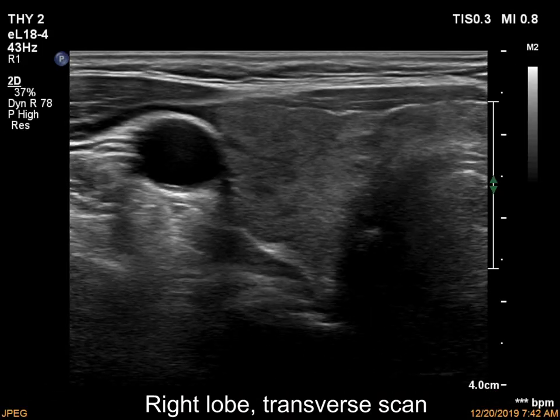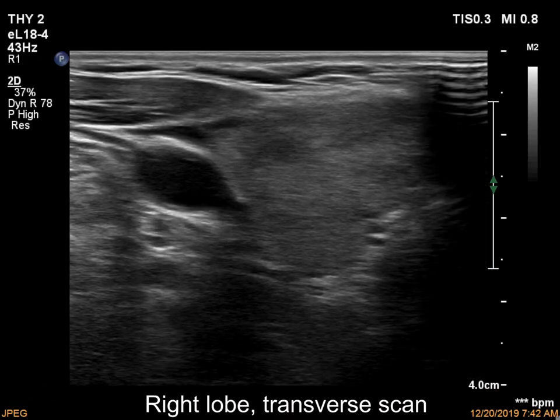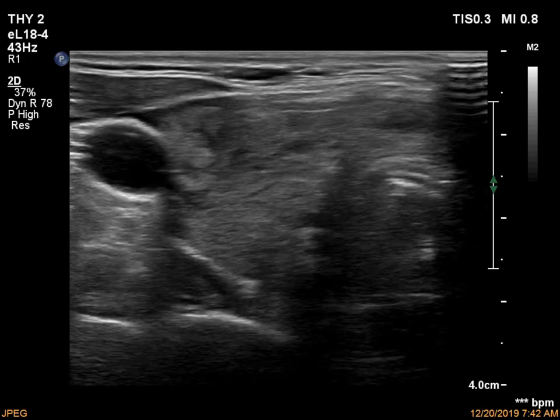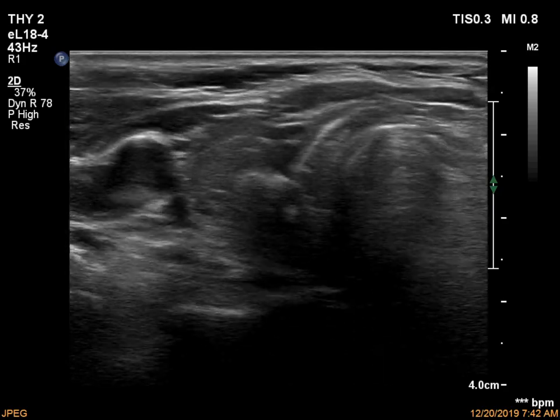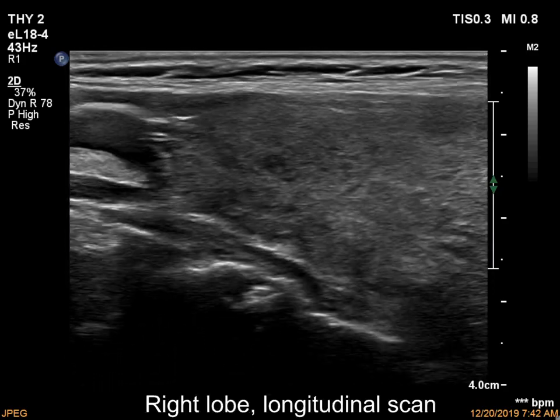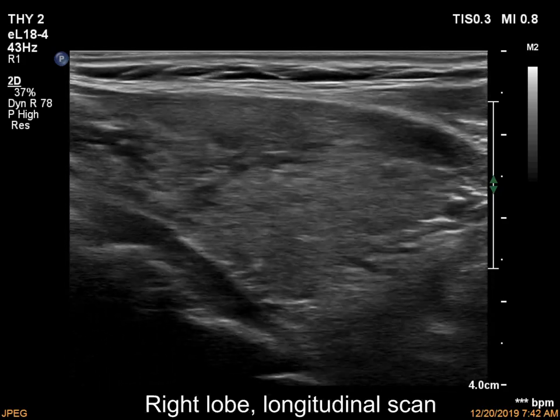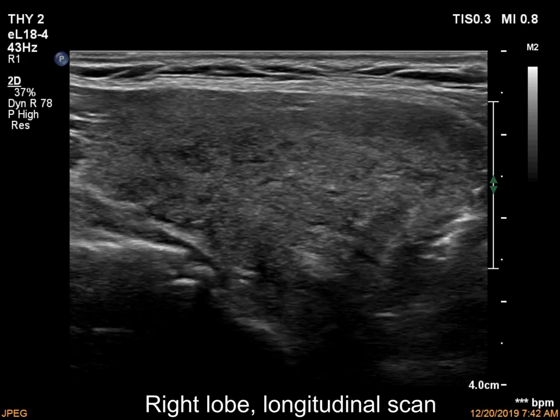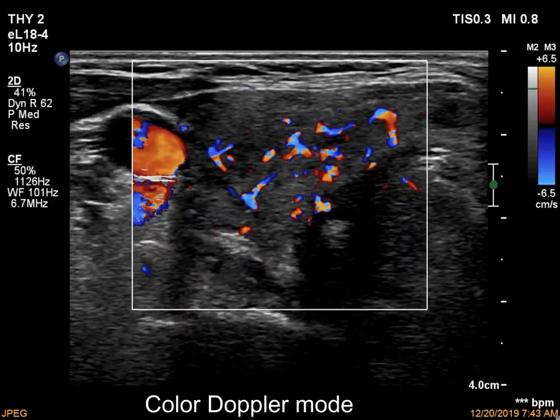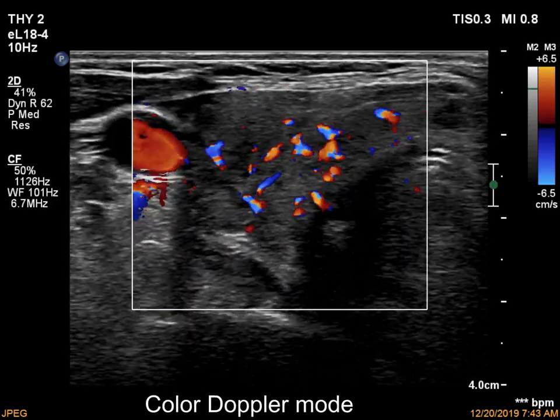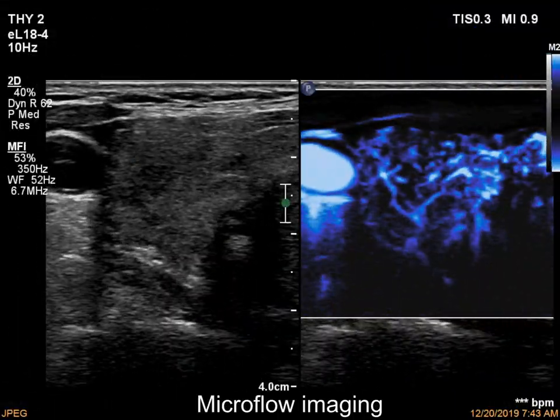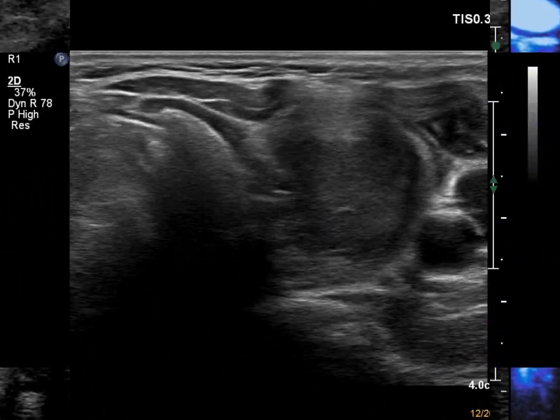The right lobe is moderately hypoechoic and has tiny, more hypoechoic areas. The pattern corresponds to autoimmune thyroid disease. The vascularity is increased both on color Doppler mode and on microflow imaging.